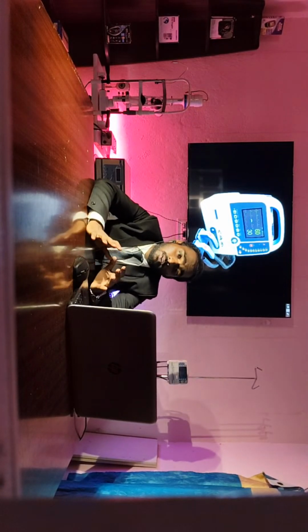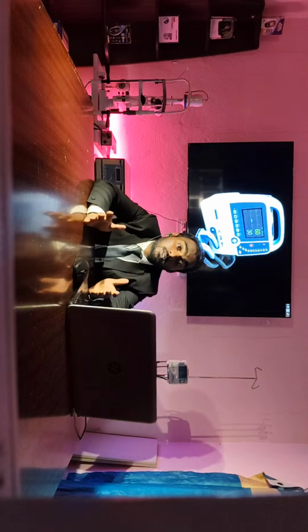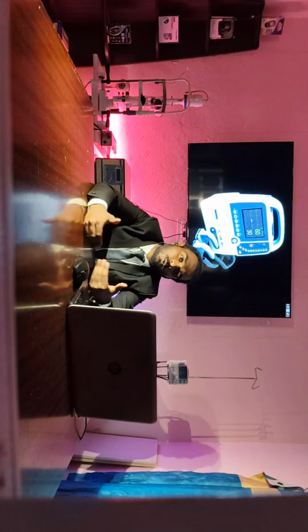The defibrillator is important because, with the patient monitoring system, infusion pump, syringe pump, or other equipment, you could calibrate with the help of patients, but that is not ethical. That is totally wrong. You should not check whether the defibrillator is working using the patient's body. It is not possible or applicable, because some defibrillators also record ECGs and automatically give you indications, like AEDs, automated external defibrillators, telling you to give a shock to the patient. So this equipment is calibrated by itself.